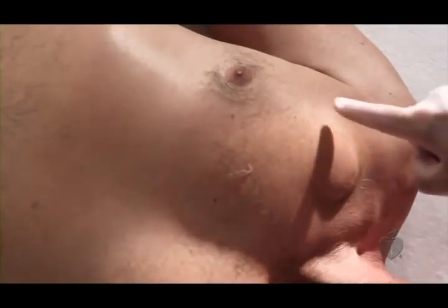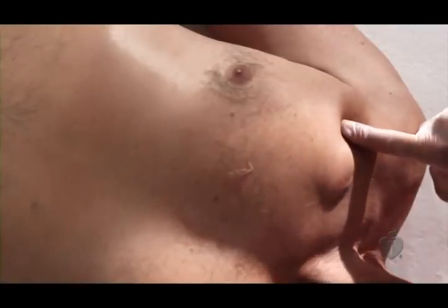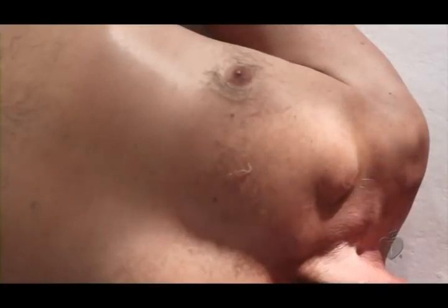Some people have implanted pacemakers and/or defibrillators in the same place where you would put the AED pads. The device will look like a round or square lump, smaller than a deck of cards. If you see this lump, try to avoid putting the pad directly over the lump.